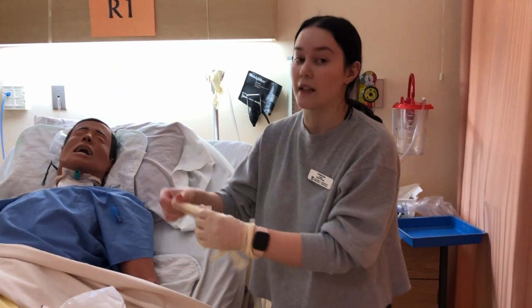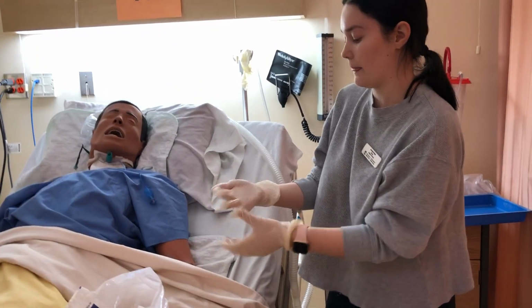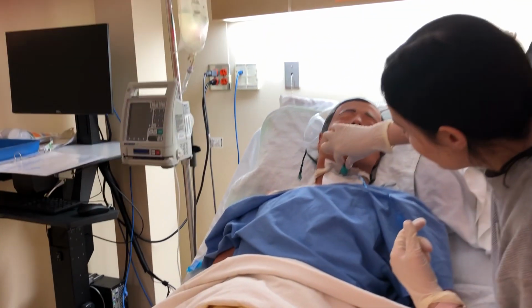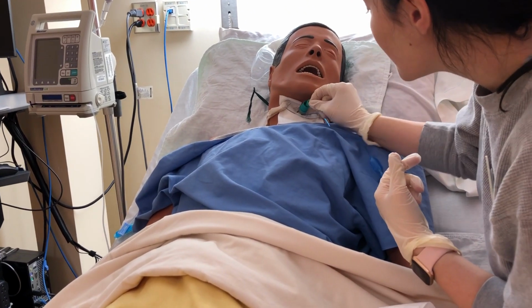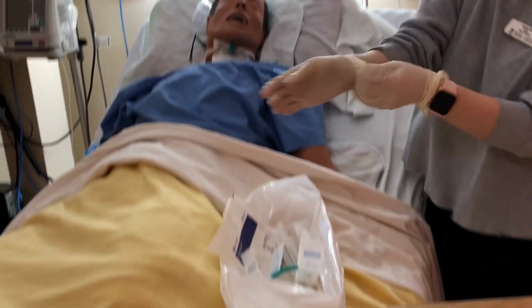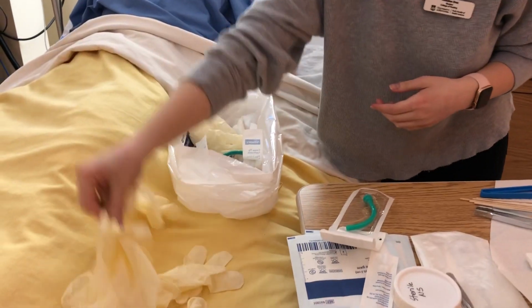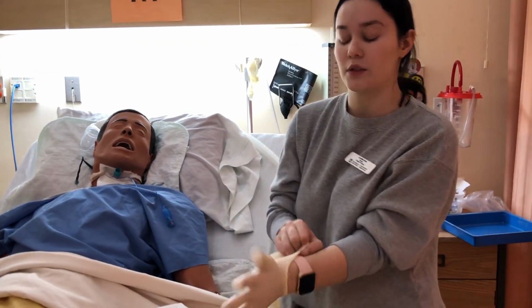Oxygen sat is still at 98%, so my patient is okay for oxygen. Okay, I'm going to remove your inner cannula now. So now this goes in the garbage along with my gloves. I'm going to perform hand hygiene and put on new clean gloves.